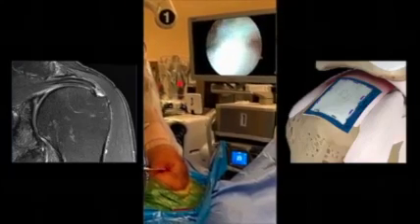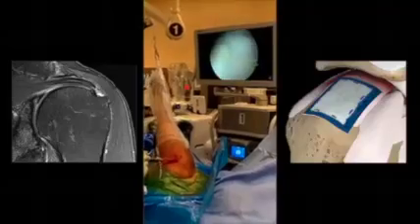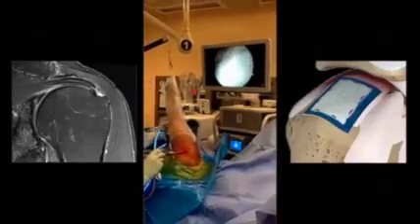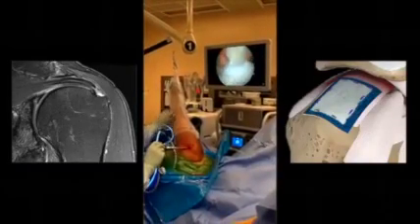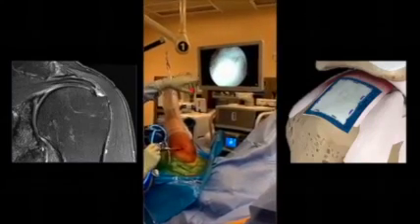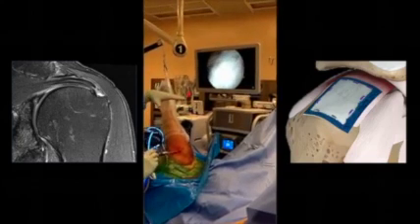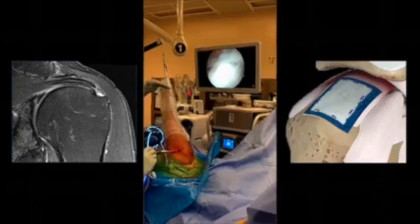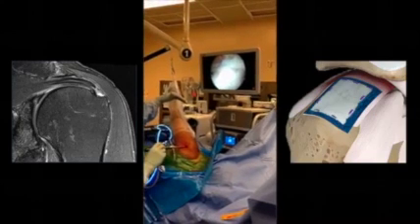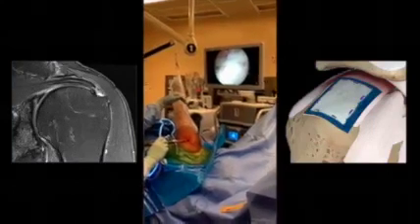Well, prior to the use of the Regeneten patch, I would have maybe debrided this, but then she misses half of her rotator cuff and she still has a source of pain and discomfort. So what we're going to do is just remove all this scar tissue here. We're going to just brush this up slightly, and I'm going to put the Regeneten patch right over top. And this patient, believe it or not, typically comes in at 2 weeks after surgery and literally can already tell me she feels better than before surgery.